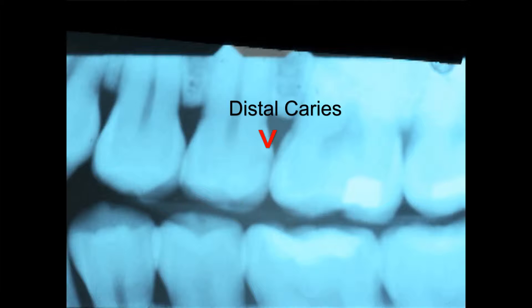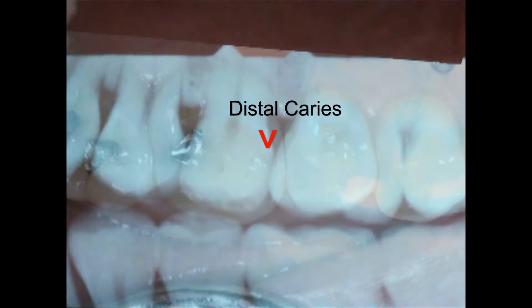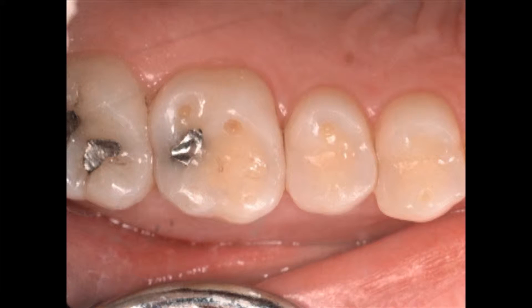Here's a class two on a bicuspid, and if you look real closely, you might be able to see a little decalcification going on in there.